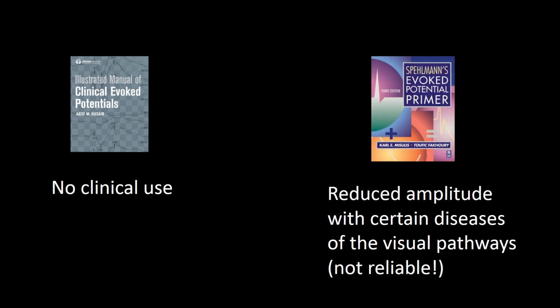Most consider that steady state pattern reversal visual evoked potentials have no clinical use. Others, that is, fewer people, consider that it does have a place in the clinical evaluation of patients, but they add that it is basically unreliable.